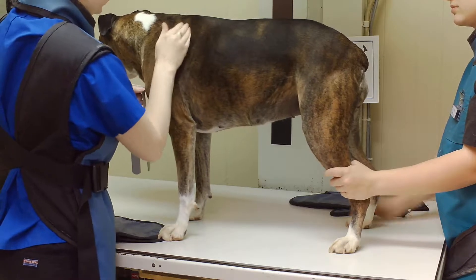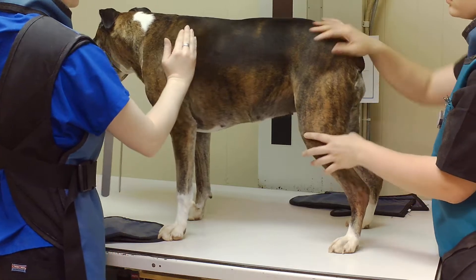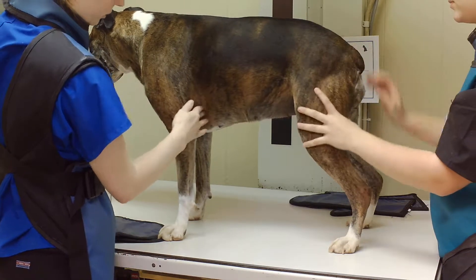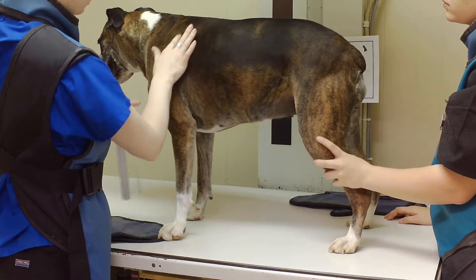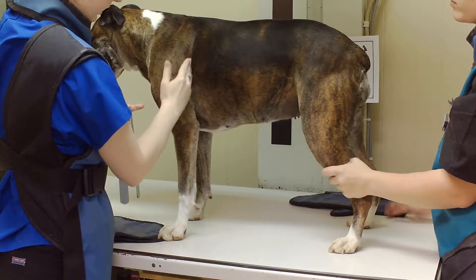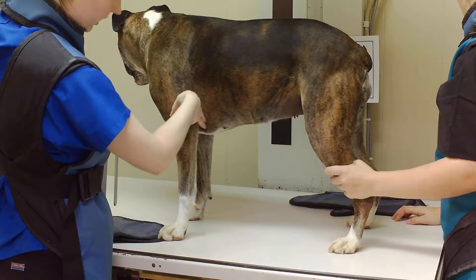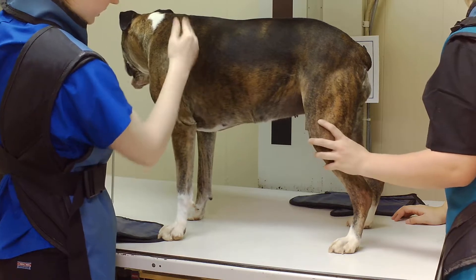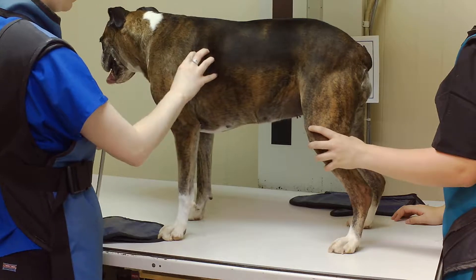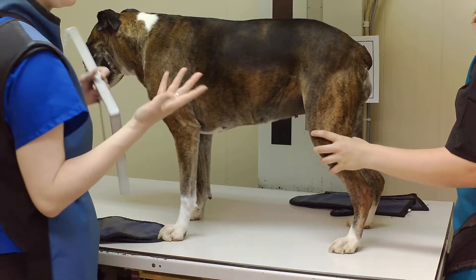That's about where the scapula is — she's got tiny shoulders. This is about the thickest part of her thorax, and also about where her heart would lie. If you feel where her scapula is and run it vertically all the way down, that's about where her parts lie. That's essentially where our primary beam is going to be focused, and that's where we're going to measure.